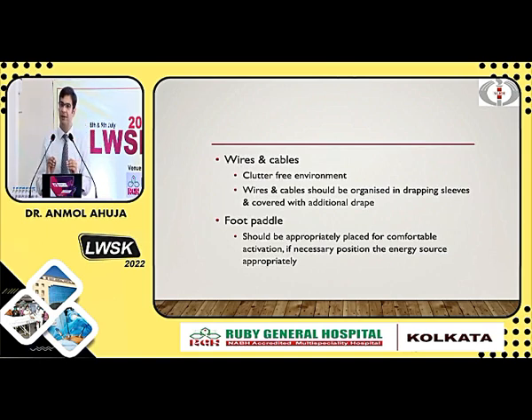You can take a break for 2-3 minutes, move around, come back and continue your procedure from there. Other things, foot pedal and wire cables, I have already told.